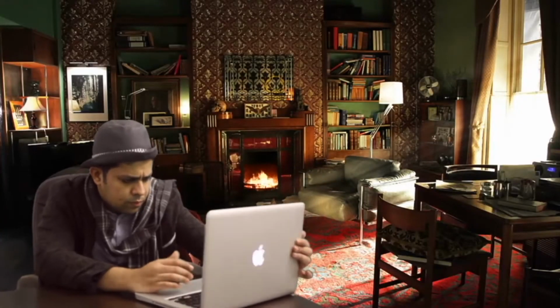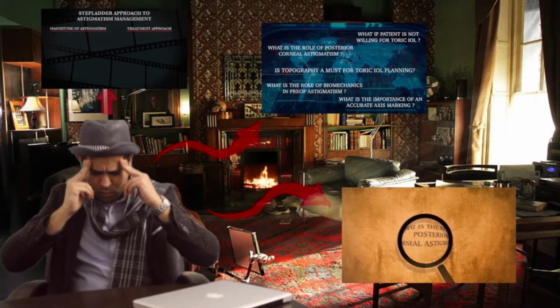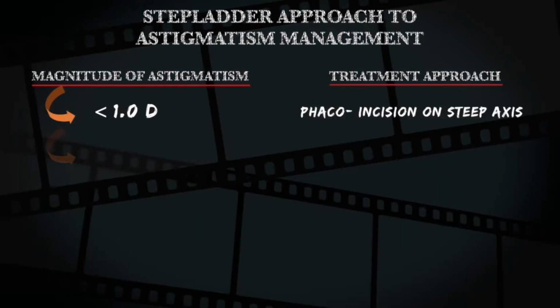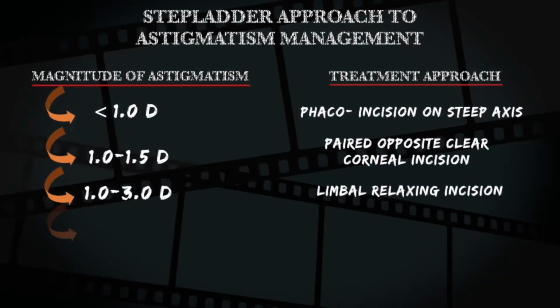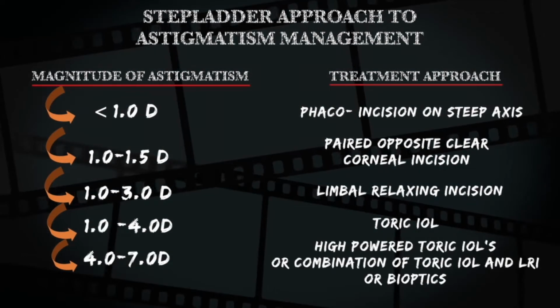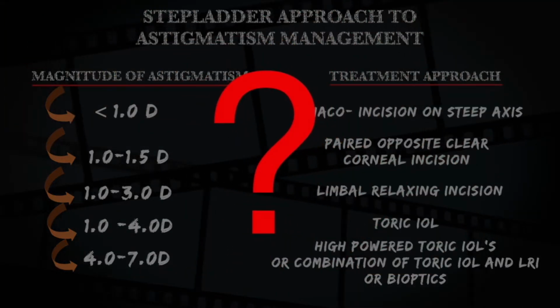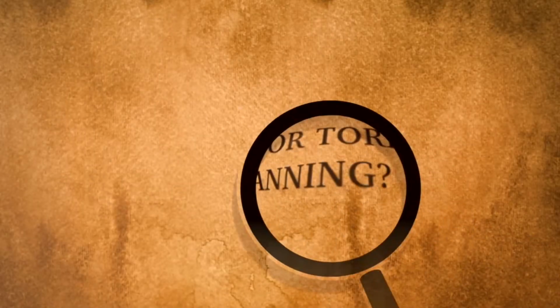Intrigued after reading the email, Dr. Holmes then entered his mind palace. He started thinking of a stepladder approach, which is normally used by all cataract surgeons to manage astigmatism. The first question which was asked is, how important is topography in planning toric IOL?